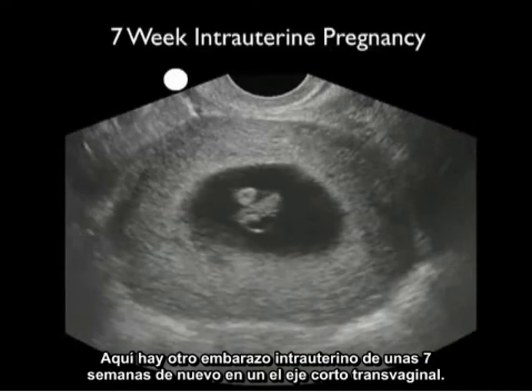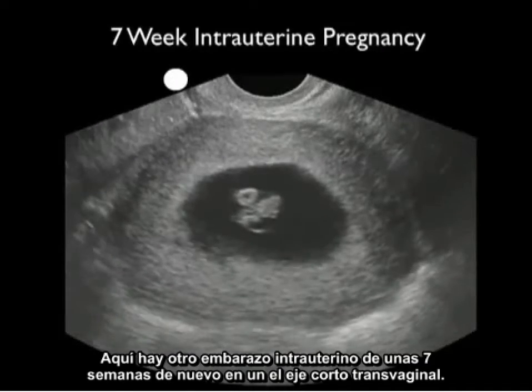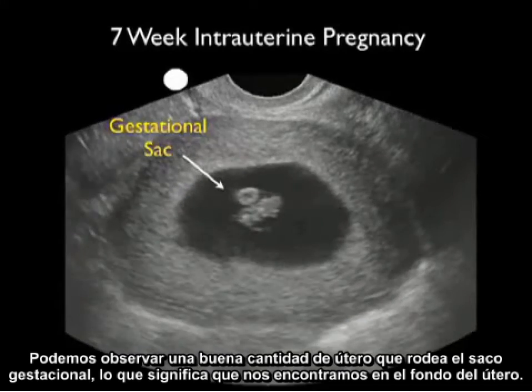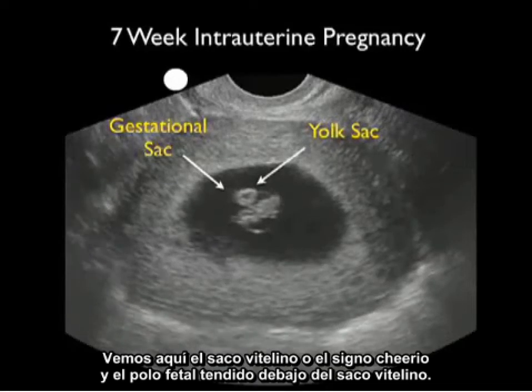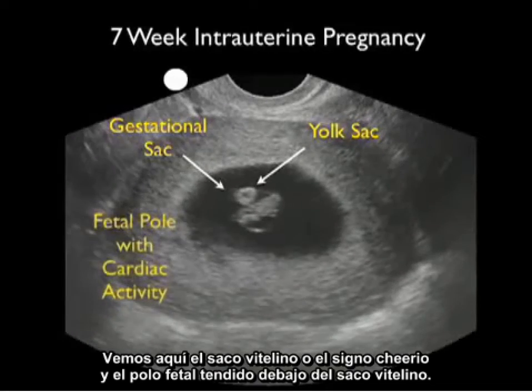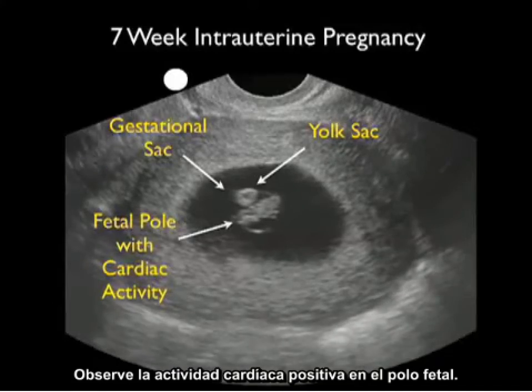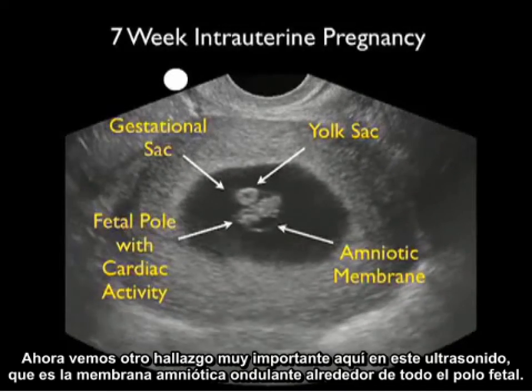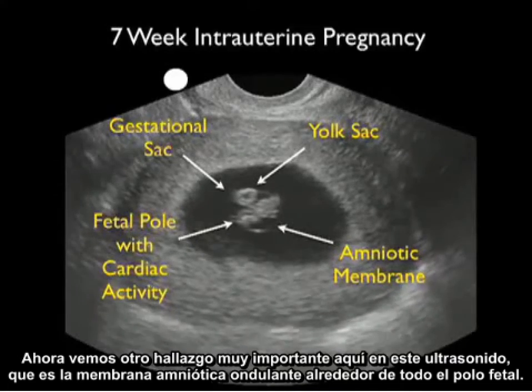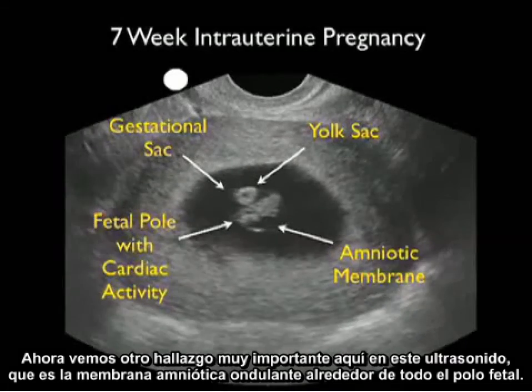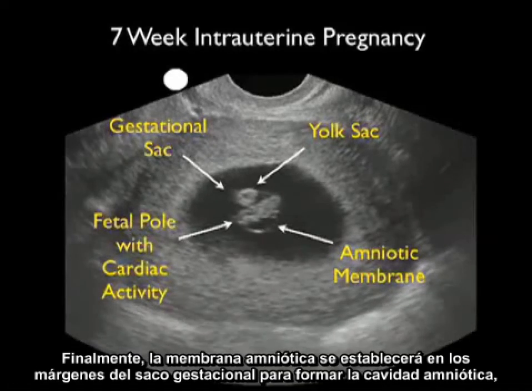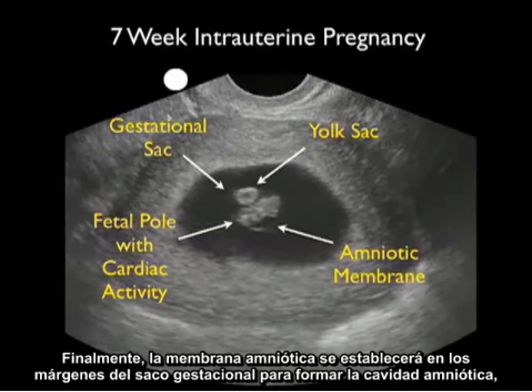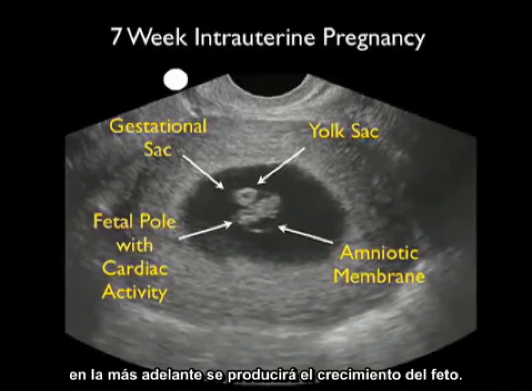Here's another intrauterine pregnancy at about 7 weeks, again in the transvaginal short axis view. Note the good amount of uterus surrounding the gestational sac, signifying the fundal location. We see the yolk sac or cheerio sign and the fetal pole stretched out below the yolk sac, with positive cardiac activity within the fetal pole. We also see a very important finding: the amniotic membrane billowing out from around the fetal pole. Eventually this membrane will plaster down on the margins of the gestational sac to form the amniotic cavity in which further growth of the fetus will occur.